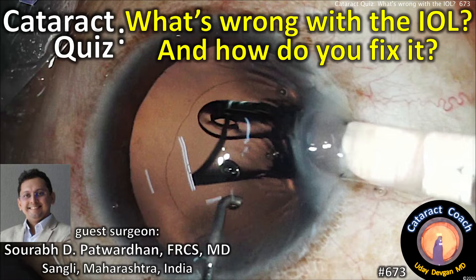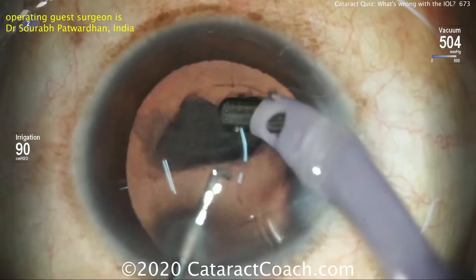CataractCoach.com. We have a cataract quiz. What's wrong with this IOL and how do you fix it? We have a guest surgeon, Dr. Saro Patwardhan from India.